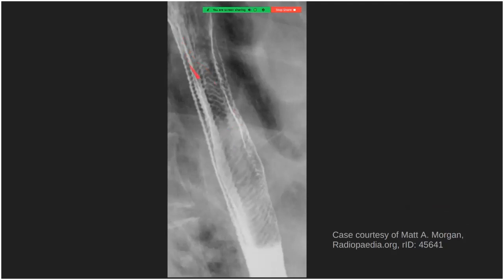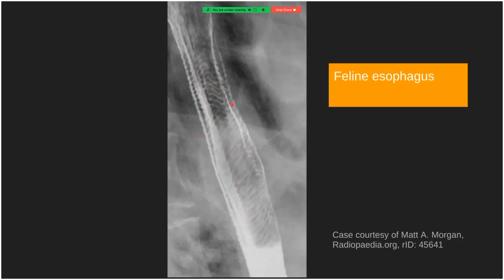This double contrast esophagram shows horizontal fine lines — uniform transverse folds — consistent with feline esophagus. This finding is caused by contraction of the longitudinal muscles of the esophagus, resulting in these transverse folds, which are transient. It is also called an esophageal shiver and is often seen secondary to gastroesophageal reflux.